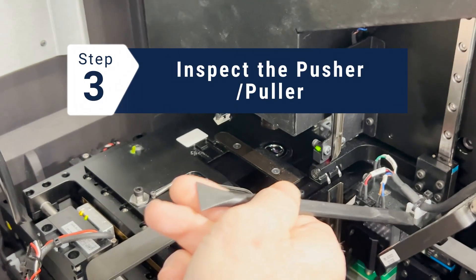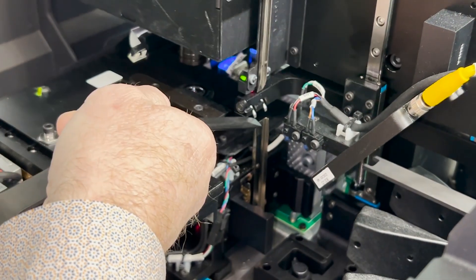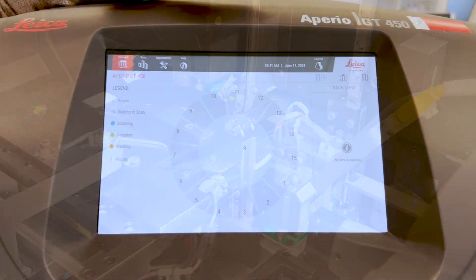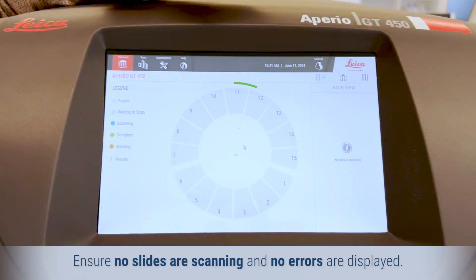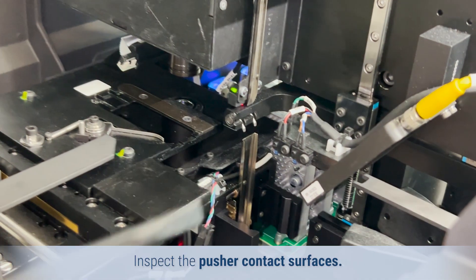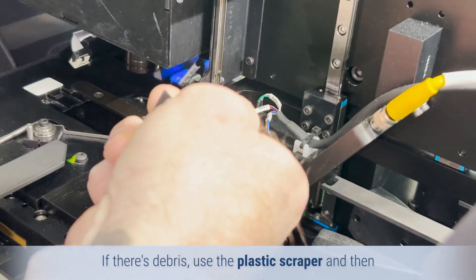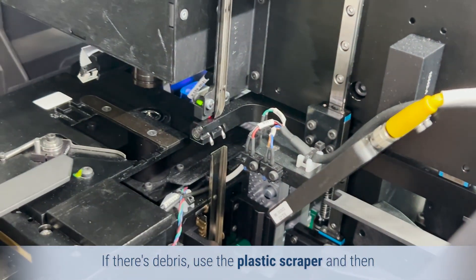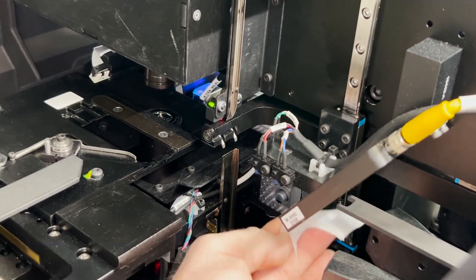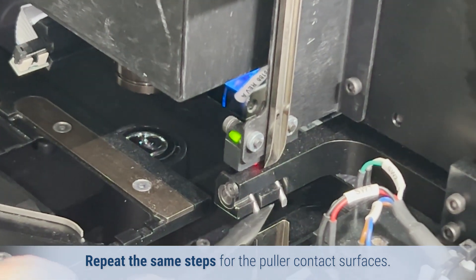Finally, we'll inspect the pusher and puller contact surface. Ensure no slides are scanning and no errors are displayed. Inspect the pusher contact surface. If there is debris, use the plastic scraper and then a lint-free cloth or alcohol wipes to clean them. Repeat the same steps for the puller contact surface.